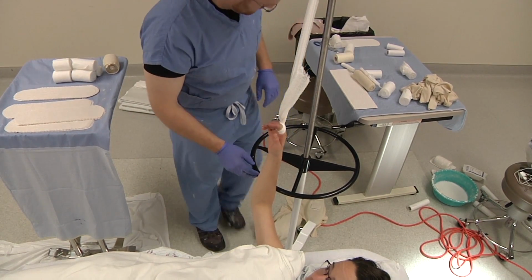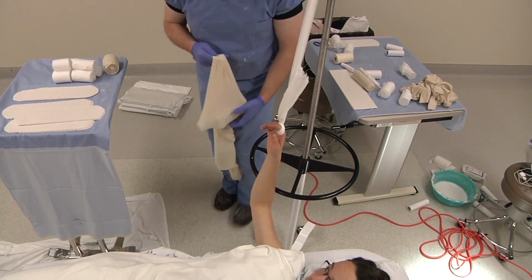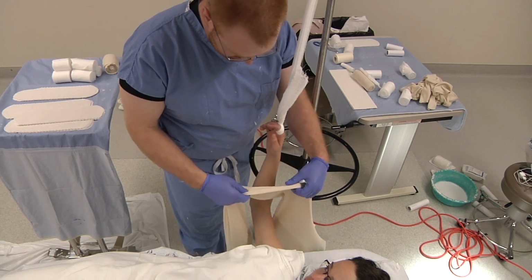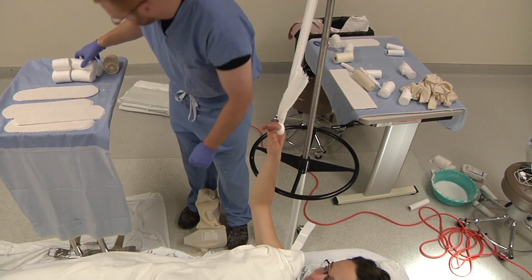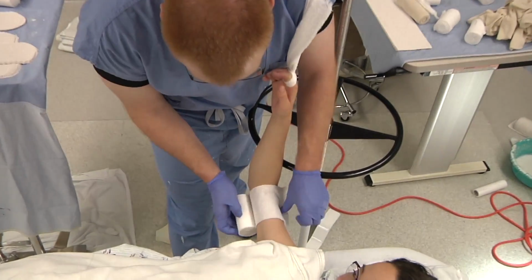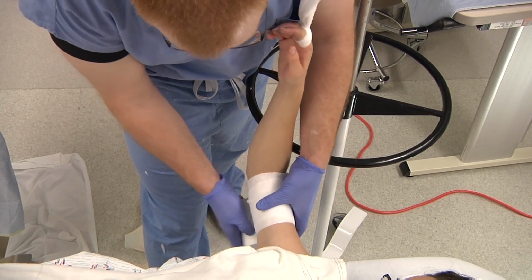So next, to aid in your reduction, primarily of a distal radius fracture, you can use traction. But before that, it's very beneficial to actually wrap the top of the arm where you'll be extending your long arm splint.